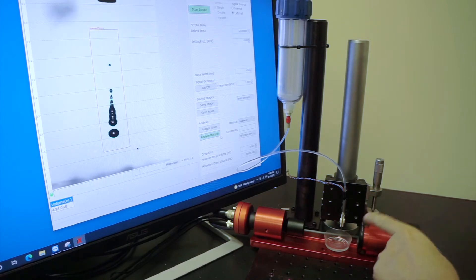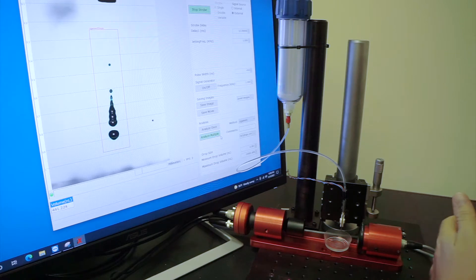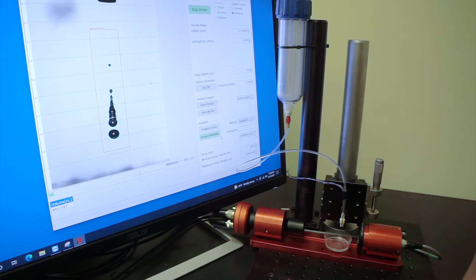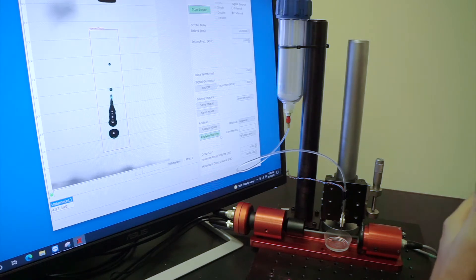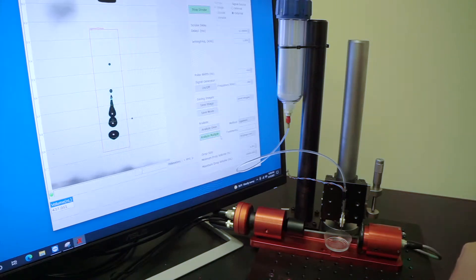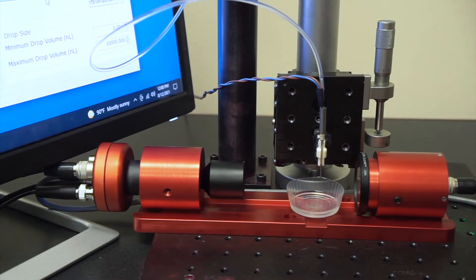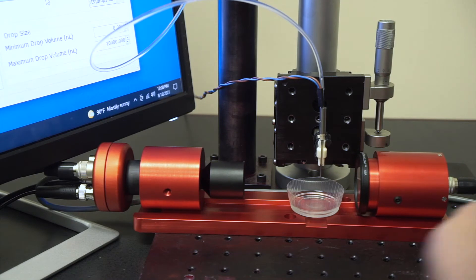On this particular system we're using a micro-dispenser, but it's compatible with any sort of inkjet printhead, micro-dispenser, or dosing system. This system is entirely self-contained.